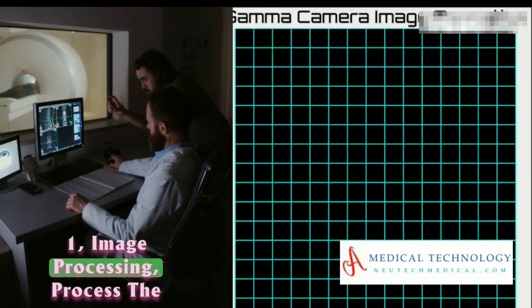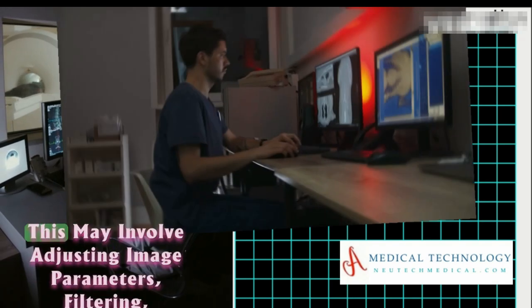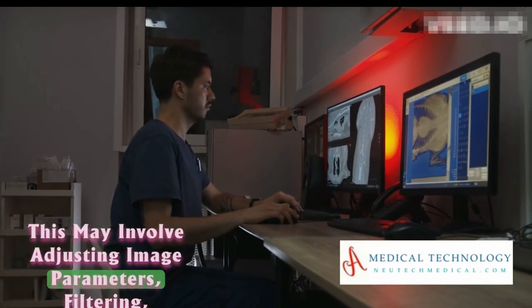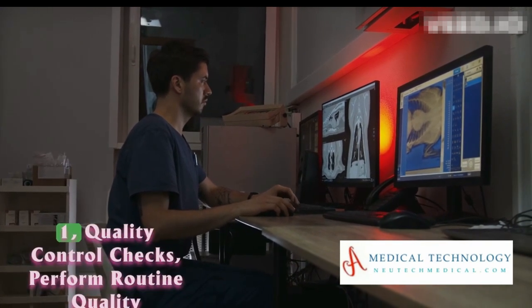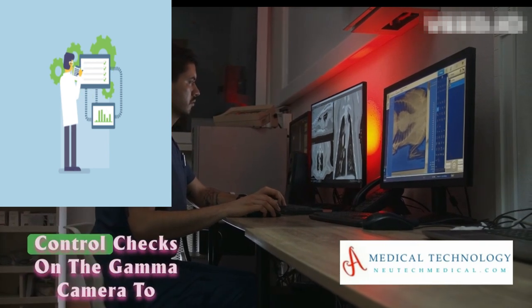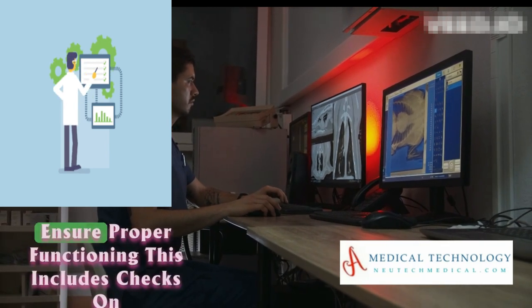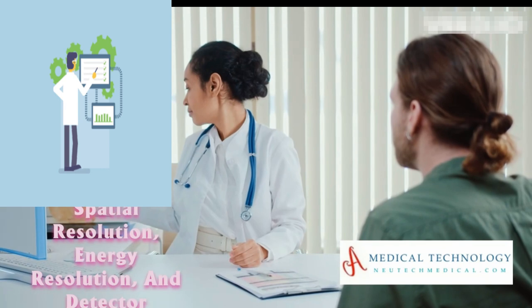Image processing: Process the acquired images using specialized software. This may involve adjusting image parameters, filtering, and enhancing image quality for interpretation. Quality control checks: Perform routine quality control checks on the gamma camera to ensure proper functioning. This includes checks on spatial resolution, energy resolution, and detector uniformity.